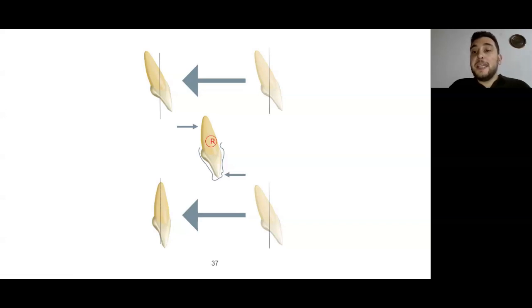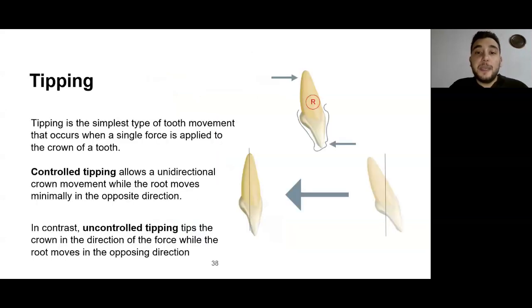So why am I explaining this? Because this is a residual. I want us to keep this example in mind whenever we imagine a movement with clear aligners, whenever we're watching a 3D simulation of a treatment setup. I want you to imagine the plastic applying this force, and how it is going to translate clinically, because we're always going to get this side effect of tipping.